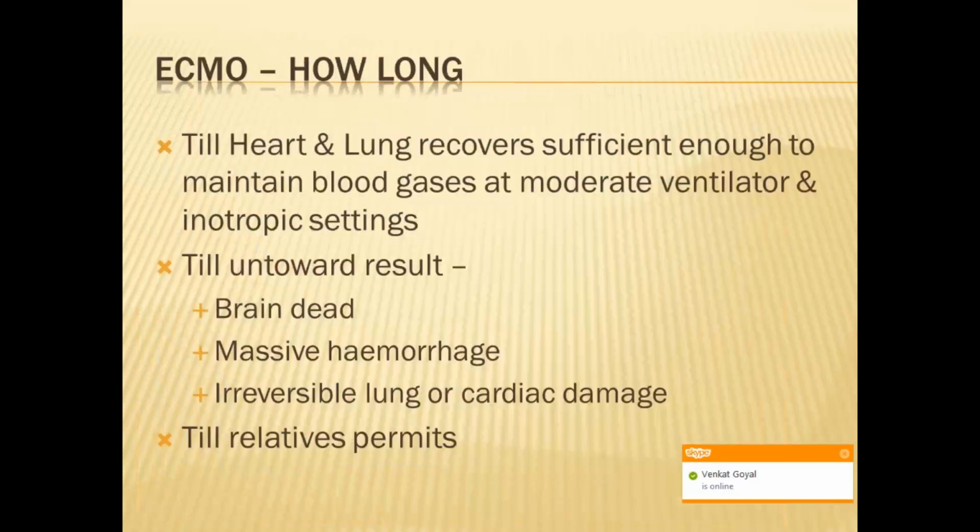The question is how long the ECMO can be run. Basically, till the time the heart and lung recover sufficiently to maintain the blood gases at moderate support. So you don't need to wean off the ECMO till the patient recovers completely. Once they start maintaining on moderate support, you can think of getting the ECMO out.